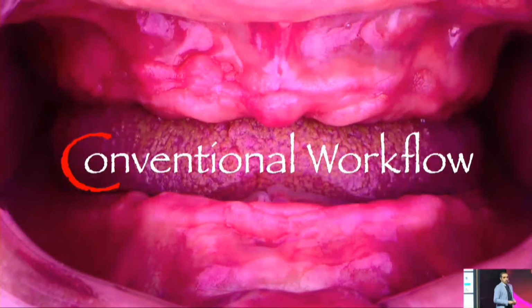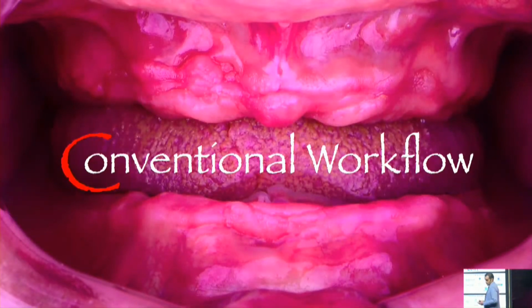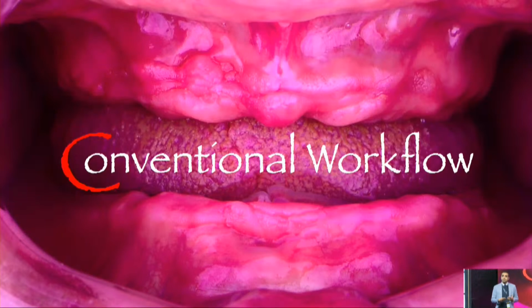But first, let's start with the gold standards. Let's start with the conventional workflow. We've been doing that for more than 30 years now. It's been working relatively well. So this is the reference that we are comparing any innovation to, simply because it's been working and this is considered the gold standard.